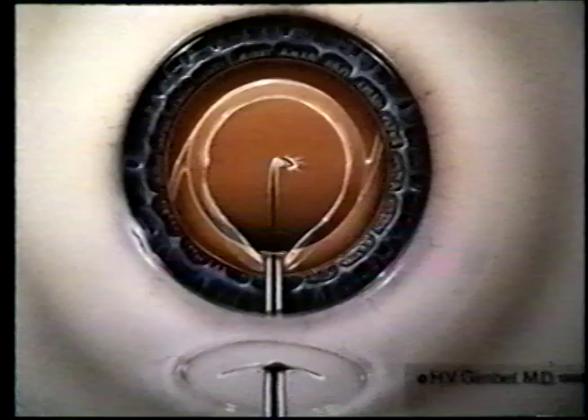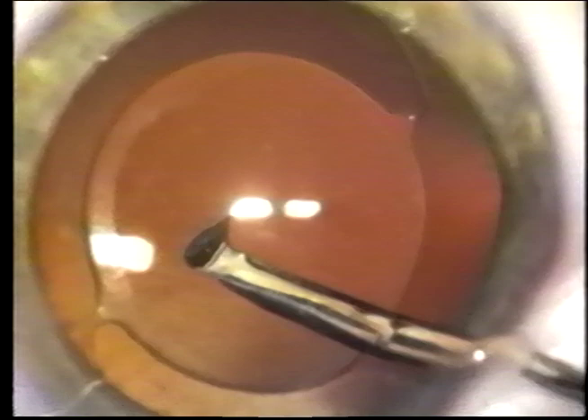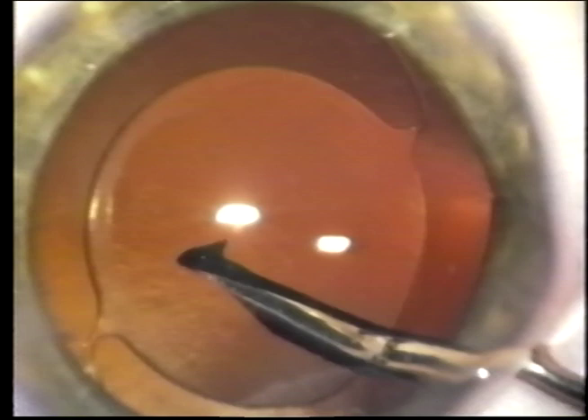To avoid this re-opacification, I've developed a technique called posterior capsulorexis with optic capture. With the lens in the bag, PCCC is accomplished using the technique just described, starting with a central puncture, adding more viscoelastic, and creating a posterior capsule opening somewhat smaller than the optic of the implant and concentric with the optic. The leaves of capsule are then anterior to the optic to avoid pearl formation depositing posterior to the optic.